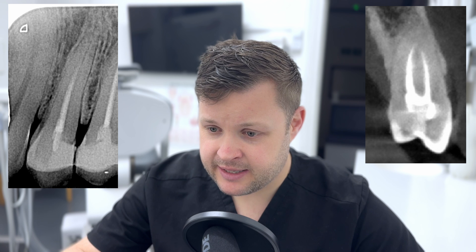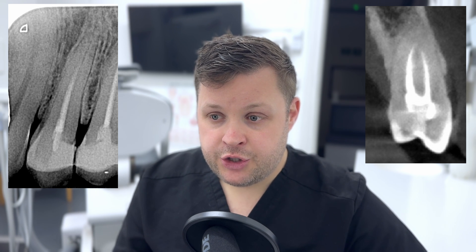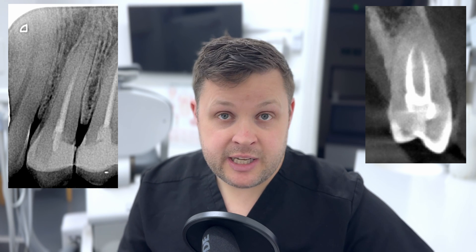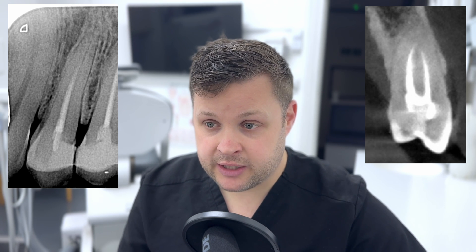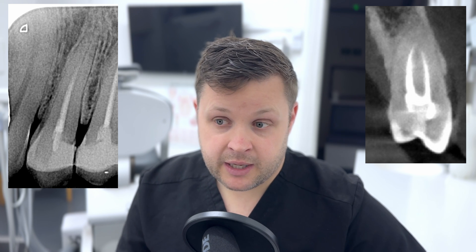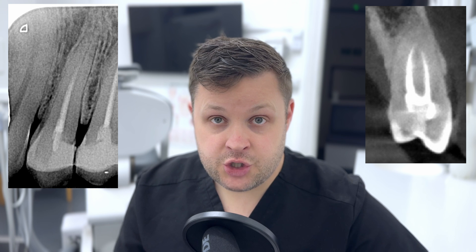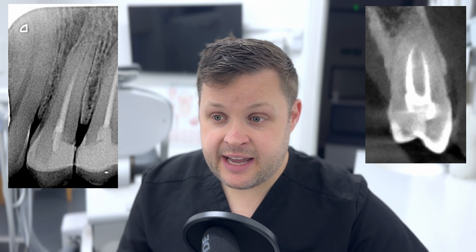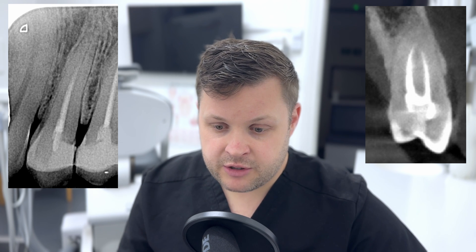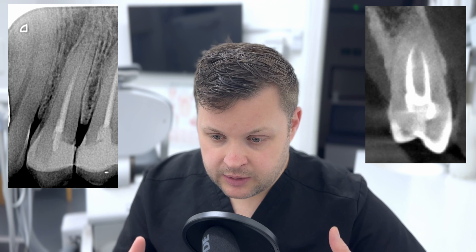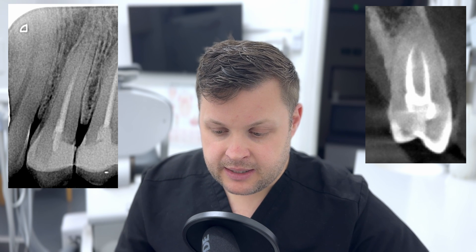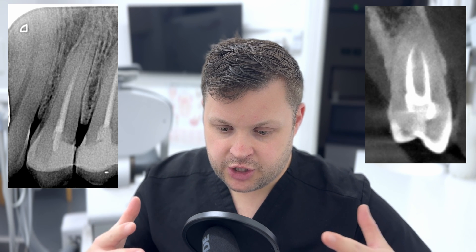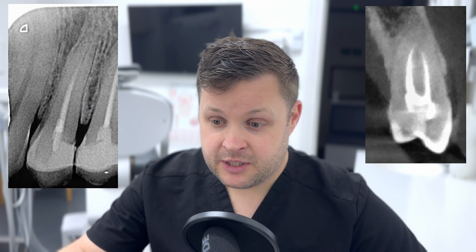I also took a CBCT for this case, and you can see it indicates there are two canals — not obvious on the 2D periapical radiograph. I was concerned about the internal anatomy. The CBCT gives us information on where to expect the join: I can take a rough measurement, so when I'm shaping the tooth I know approximately where that join is, around 18 millimeters.